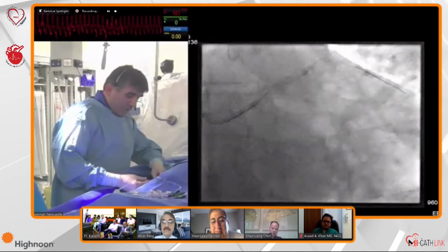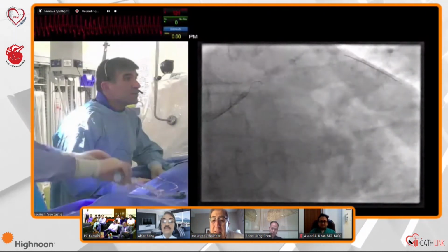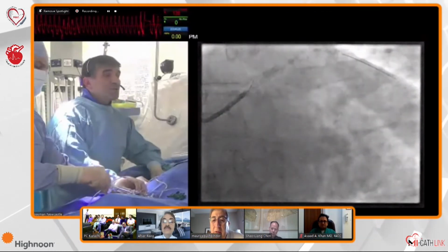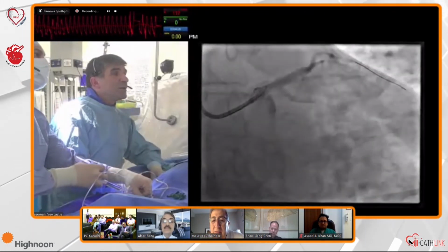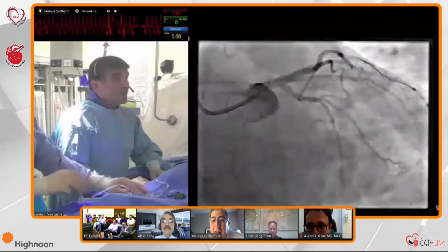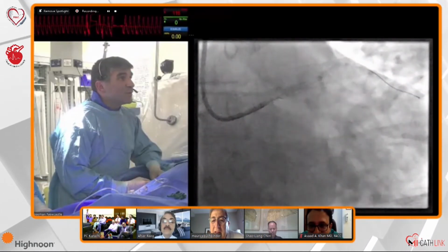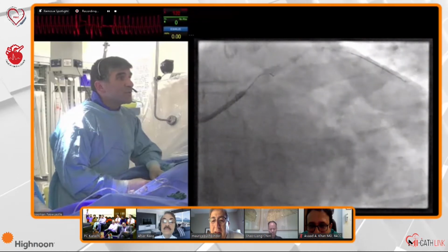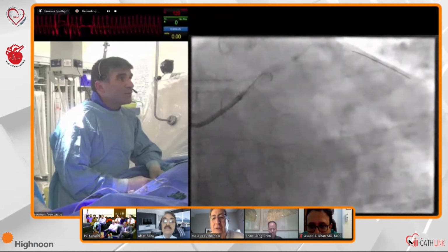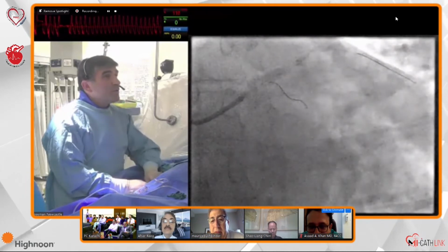Sometimes there's the temptation, even if it's simple, to leave everything alone, because the EBC trial has shown us even a single stent with ballooning is enough. Okay, so you can see. I'm going to take a cine here. You're going to cross it. Here we go. Yes, I think we need to dilate a little bit more, but you could argue I could leave it. Because we did balloon dilatation and there's calcium and deformity, I think the chances of restenosis are high, and this will be a very good case to restudy. Absolutely. So I think we're in.